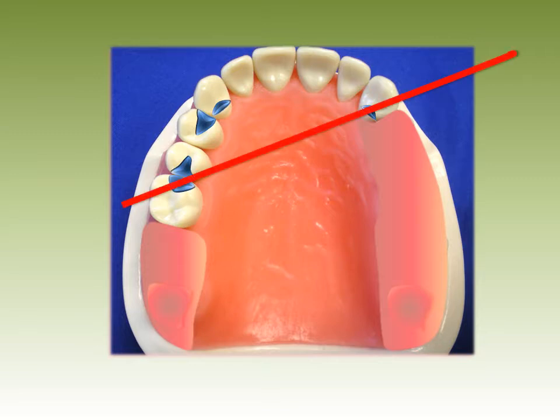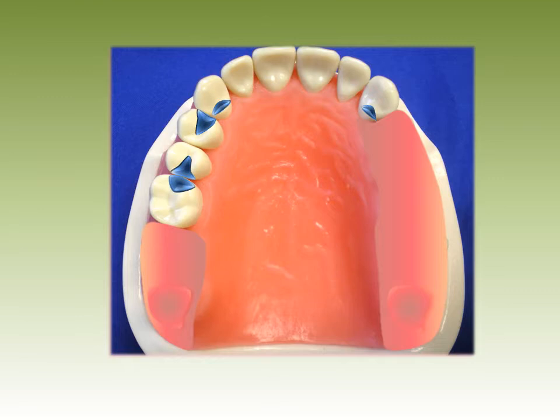Now we are ready to join these components across the arch with a palatal plate major connector. The connector is extended so that the base will cover the tuberosity. Draw the bead line on the cast.